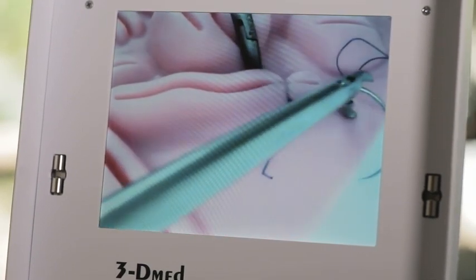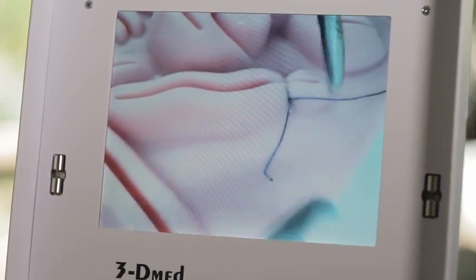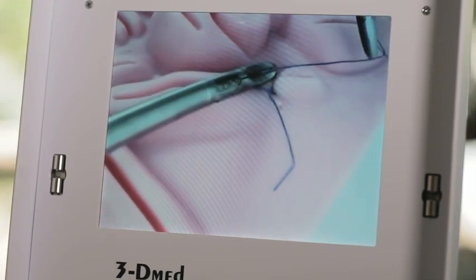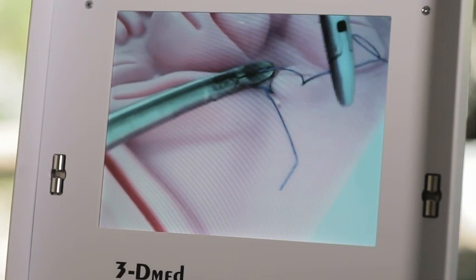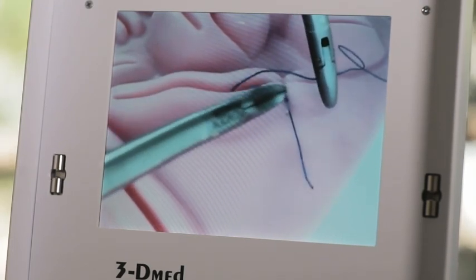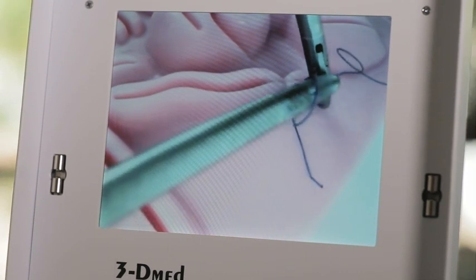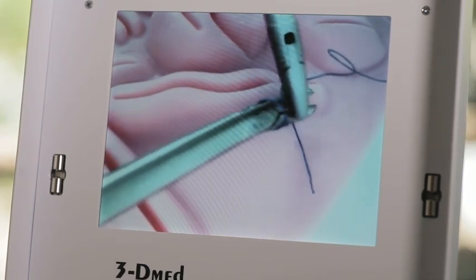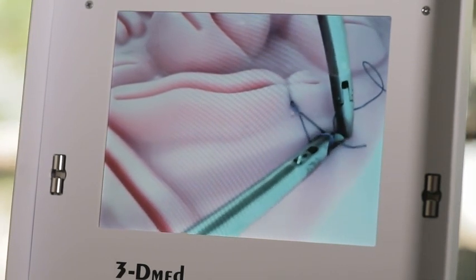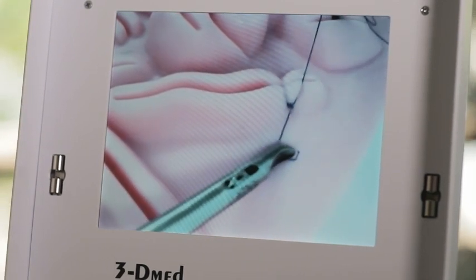I'm going to demonstrate that more clearly in this next one. I will give myself more slack this time and have the suture pointing at me as if it were the hub of the needle. I can wrap around it in a perpendicular fashion, then pick up the tail end, and there's my suture knot.